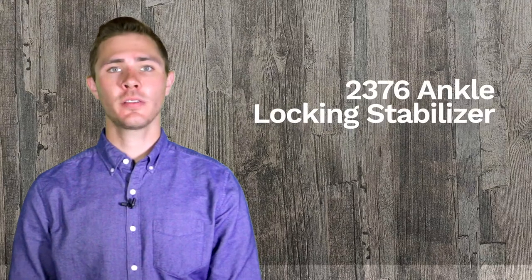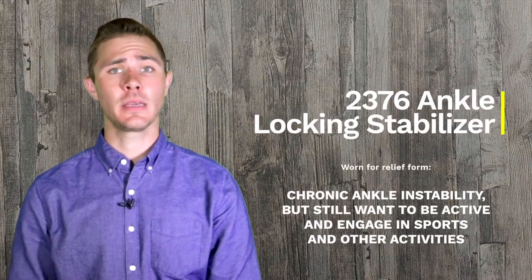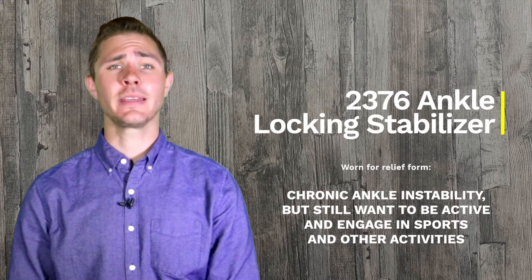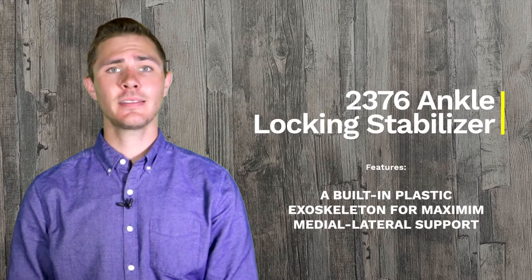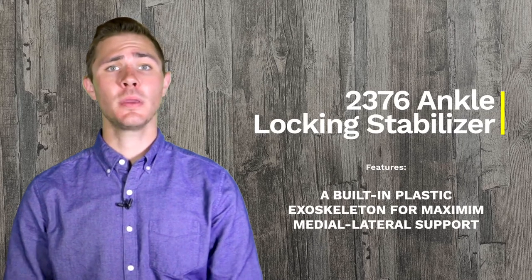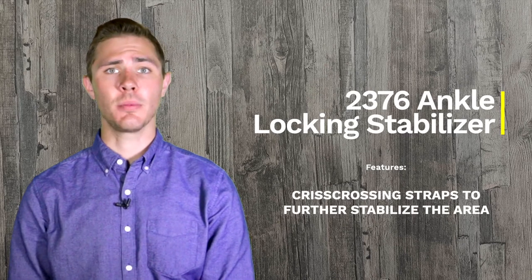The OTC model 2376 ankle locking stabilizer is usually prescribed for people who have chronic ankle instability but still want to be active and engage in sports and other activities. It features a built-in plastic exoskeleton for maximum medial lateral support, along with crisscrossing straps to further stabilize the area.